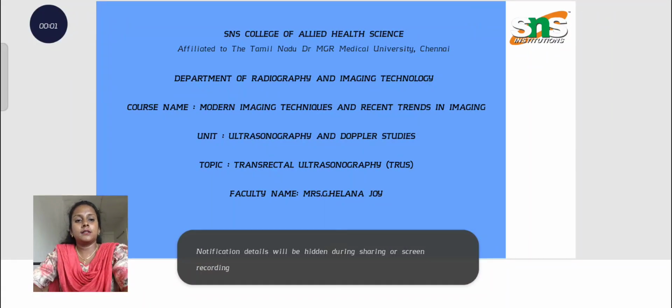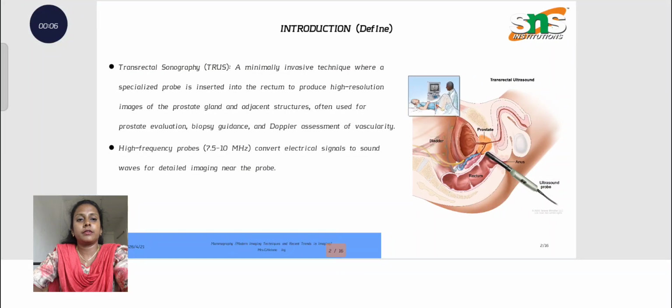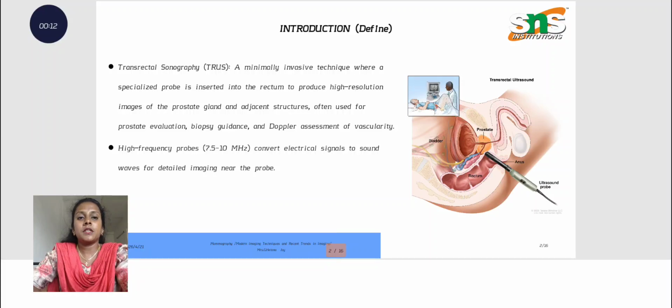Hello all. In this video we are going to discuss transrectal ultrasonography. Transrectal ultrasonography is a minimally invasive technique where a specialized probe is inserted into the rectum to produce high resolution images of the prostate gland and also adjacent structures, which is often used for the evaluation of the prostate, biopsy guidance and also the Doppler assessment of the vascular regions.